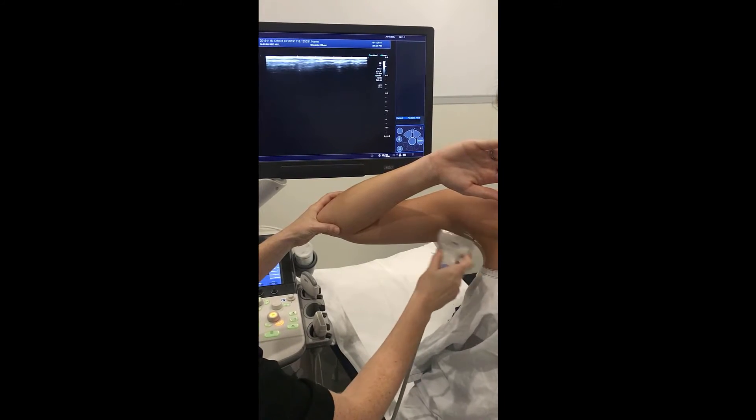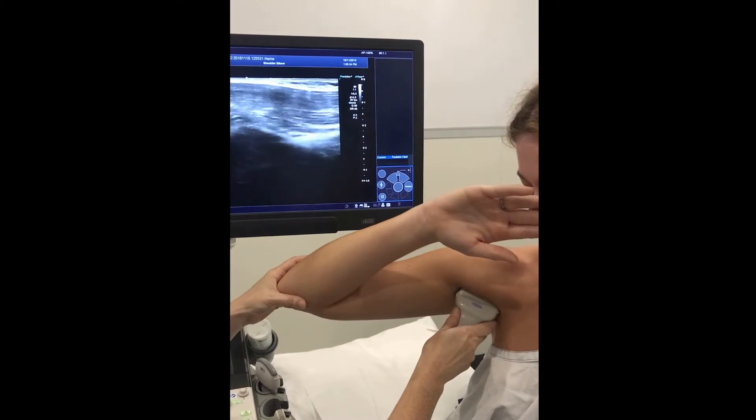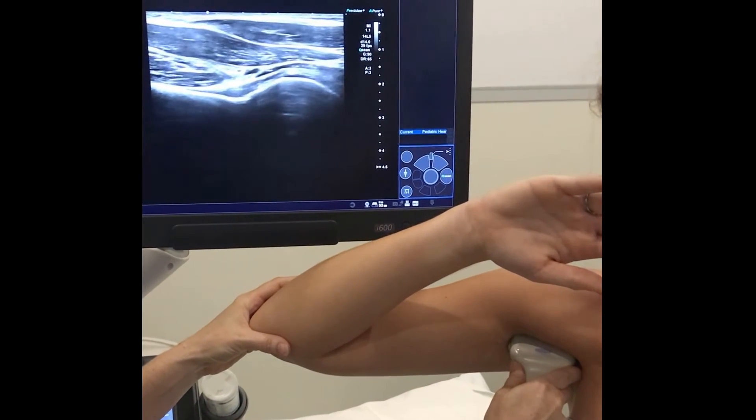For the anterior approach, let your probe fall onto that line of the anterior axillary fold, then push up just behind it until you can again see the humeral head and neck.